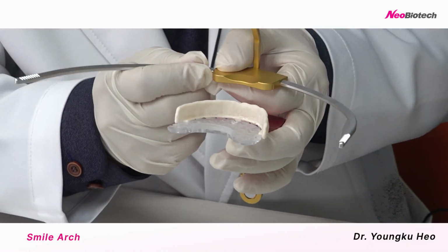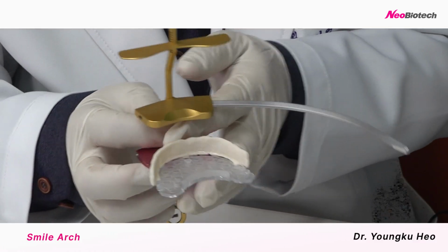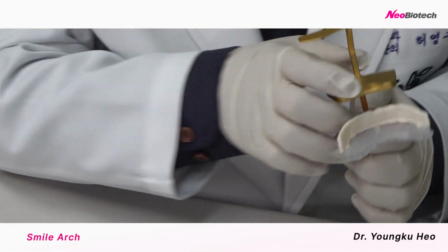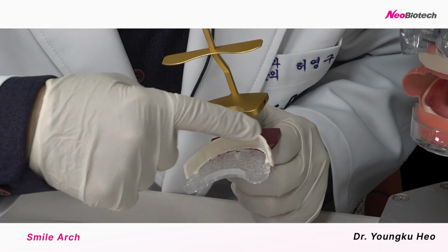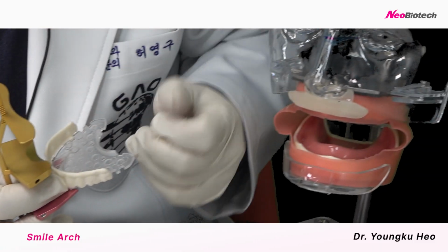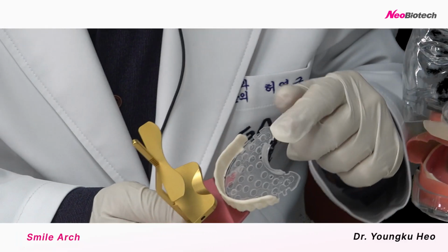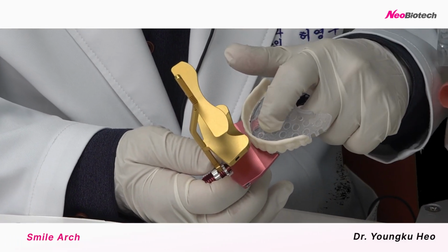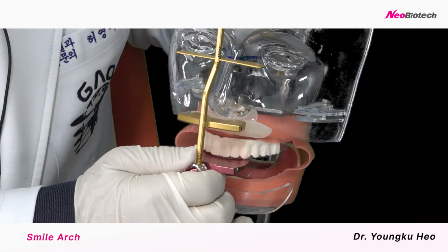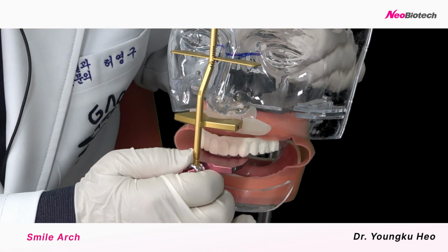You can take this out. All right. And using this impression material right here, like heavy body, then you can make an impression like this, right?